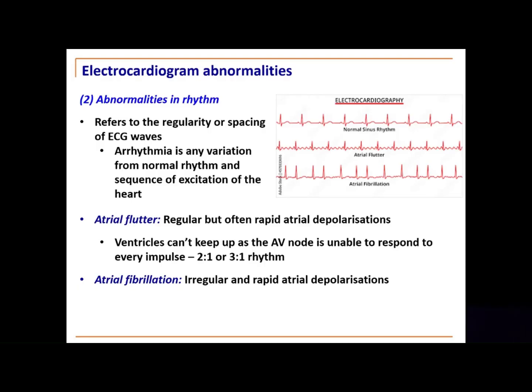And you can see that in the fibrillations that you're seeing in there. And basically the atria start to fibrillate or quiver instead of contracting effectively. So you get an irregular heartbeat. So the atrial fibrillation leads to an irregular and often rapid heartbeat.